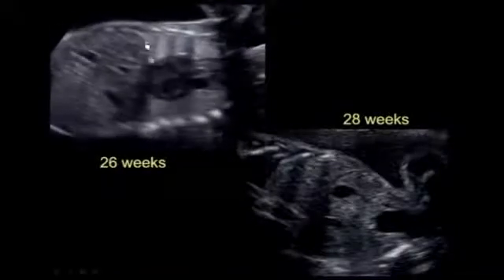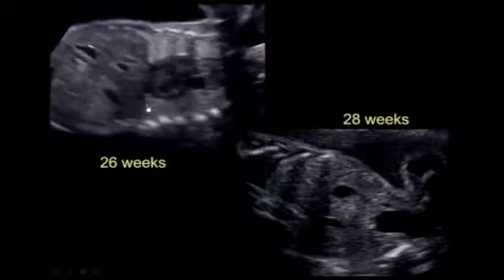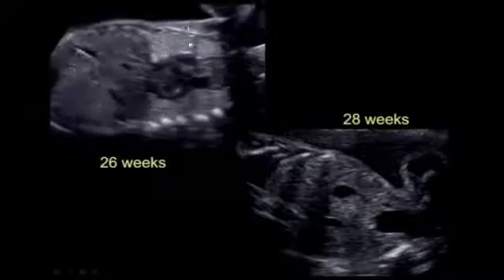And here's the image of the diaphragm at 26 weeks in the same fetus, and we read this out as normal, no diaphragmatic hernia, and I agree with that reading. Here's the liver, here's the stomach, the diaphragm, the 2 lungs, no hernia at this time.